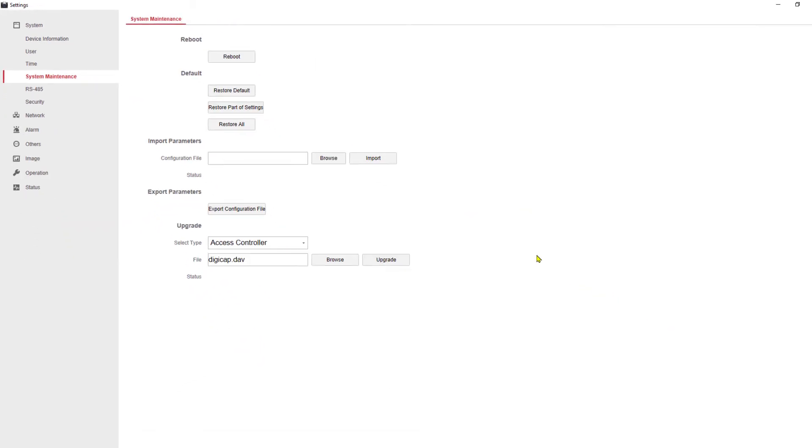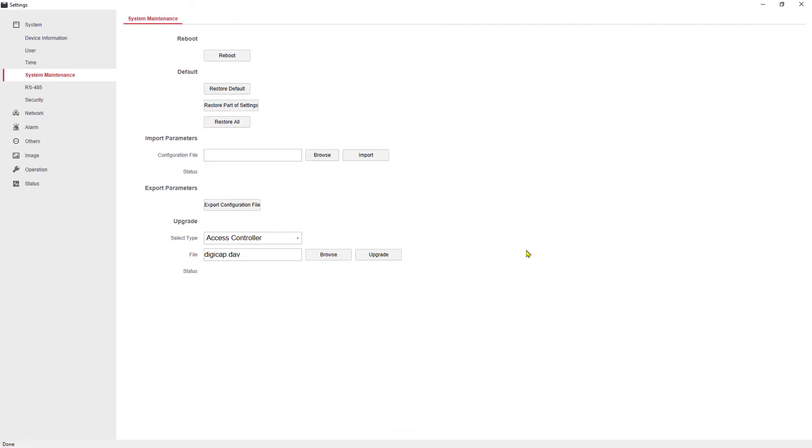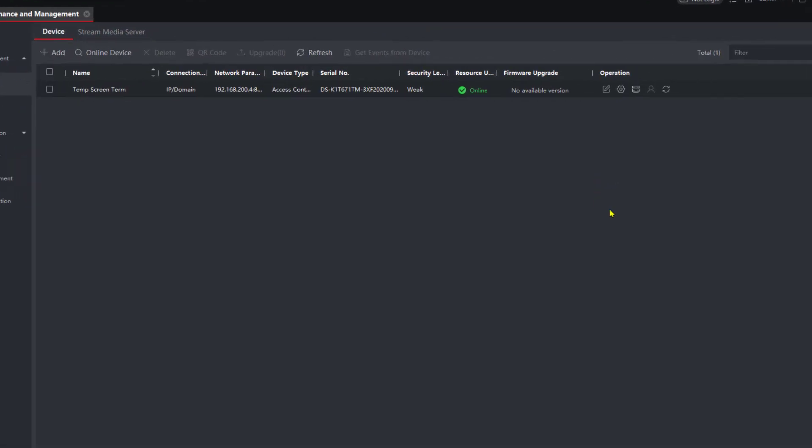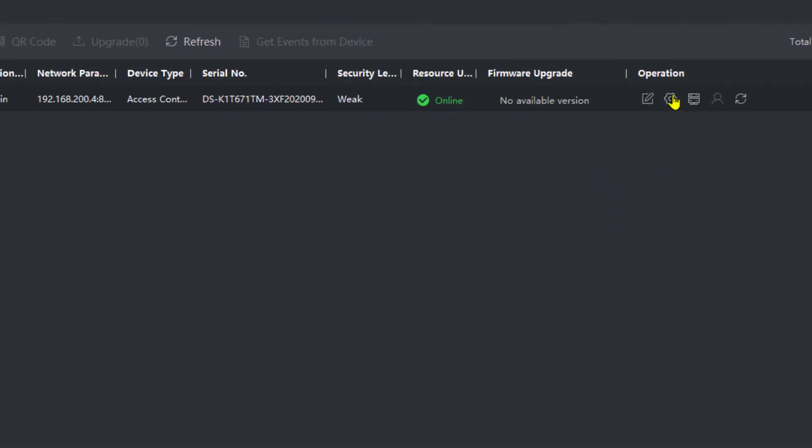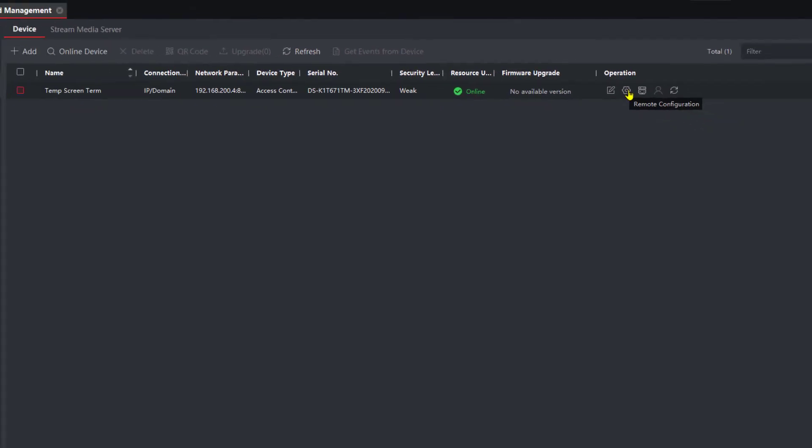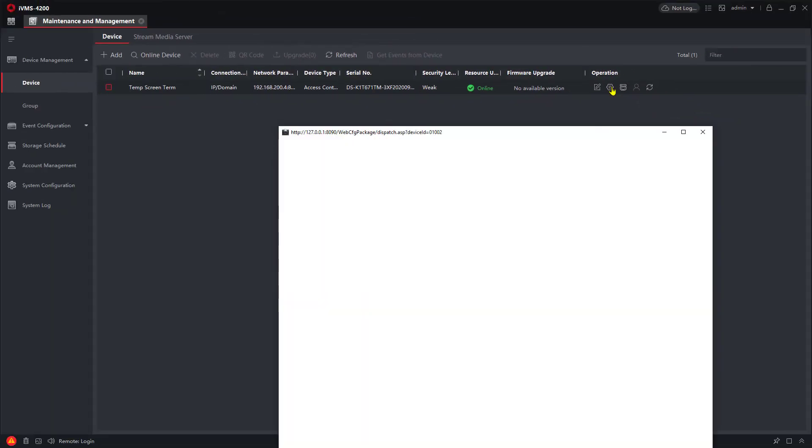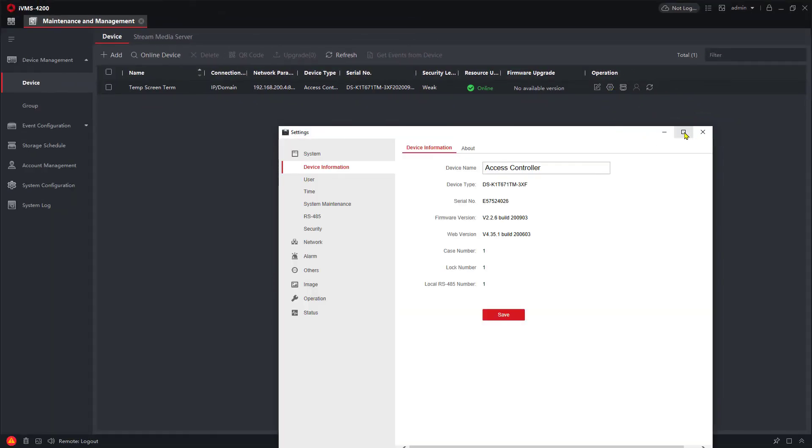However, it's going to actually disconnect because it's going to do a reboot of the system. You will get an on-screen message telling you that you need to reconnect. At that point, all you're going to do is come back into the IVMS 4200 and click again on remote configuration.